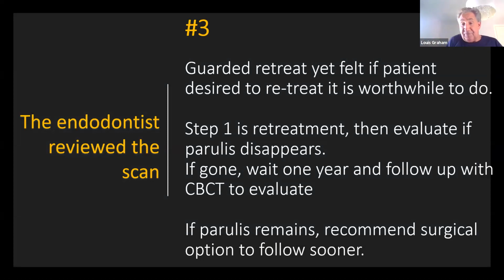If in a year the periapical lesion isn't healed, or if the periapical lesion is still there in 3 or 4 months, we're going to have to do something. But if the lesion hasn't really healed, we could always go in and do apical surgery.